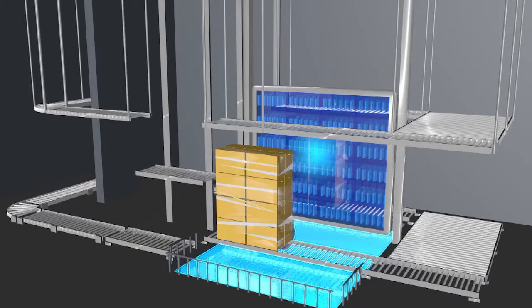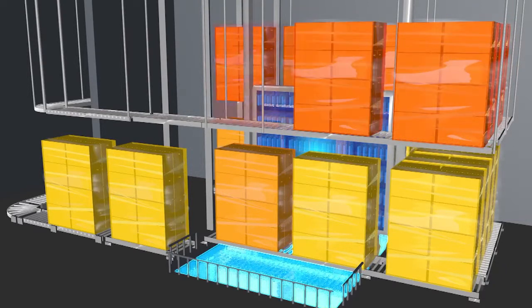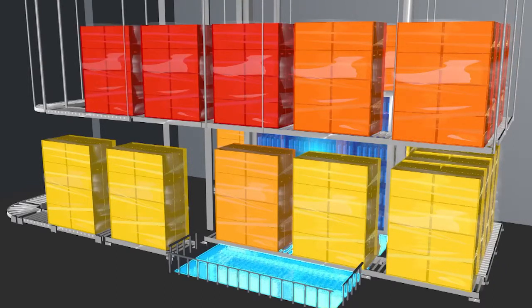The necessary radiation dose is achieved by conveying the products multiple times around the radiation source, with up to 24 pallets in the radiation field at the same time.